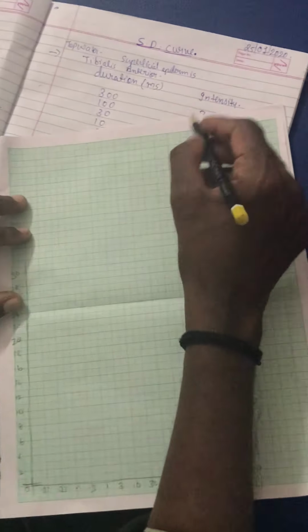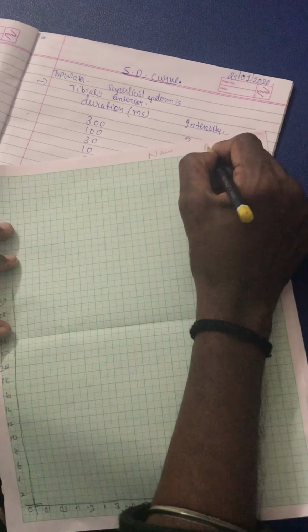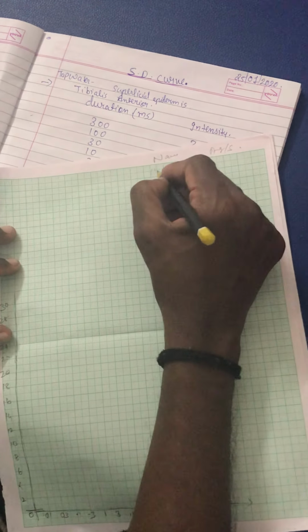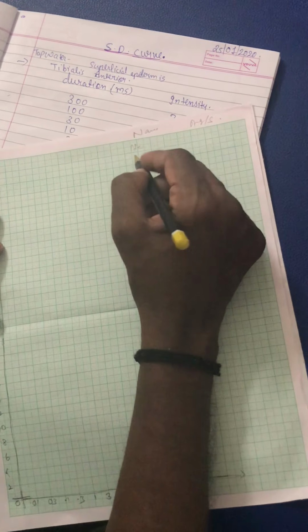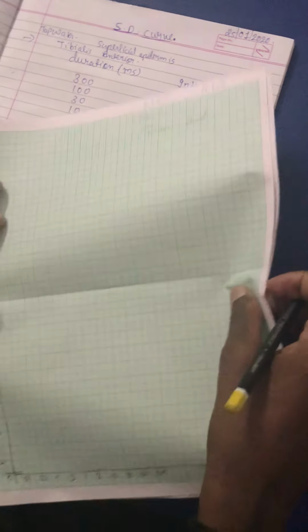Now what I will be writing here is my patient's name, his demographics, basically age and sex, his hospital number, and what muscle I did, tibialis anterior, that I actually did.